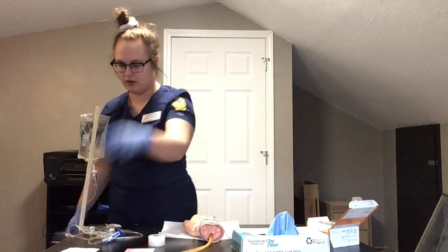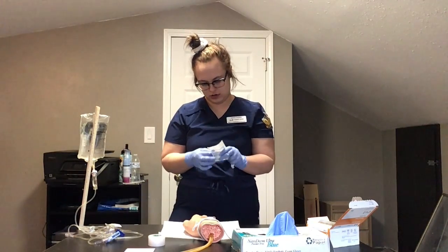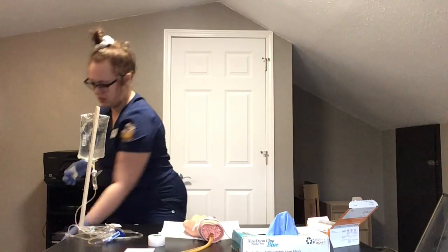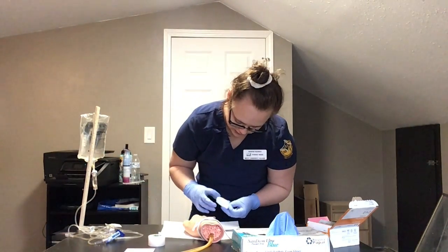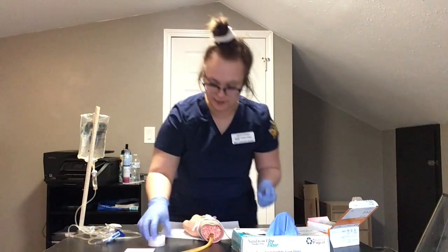Okay. Now I'm gonna get a gauze pad. Gonna place that underneath the IV. Then I'm gonna get some tape.